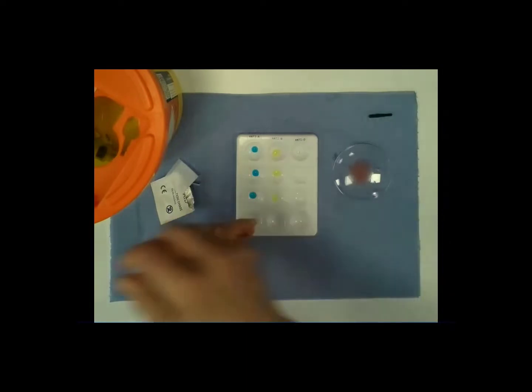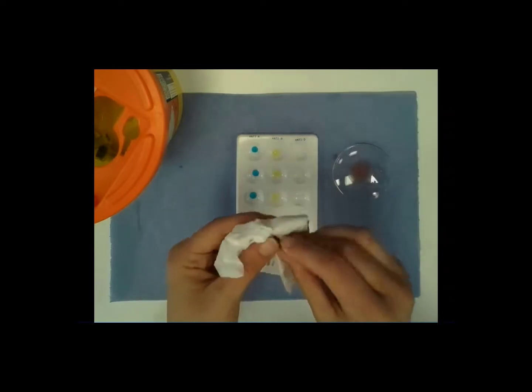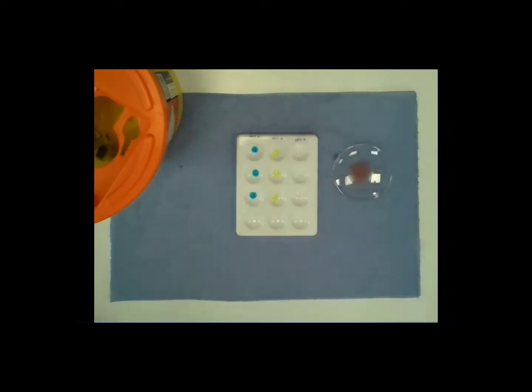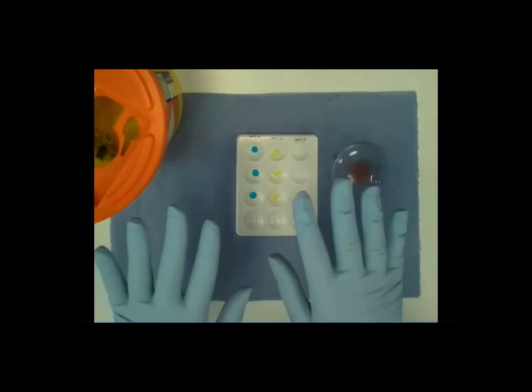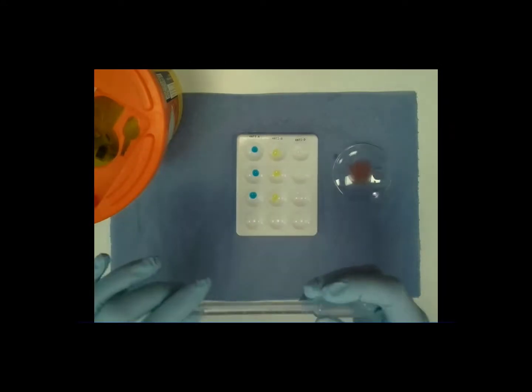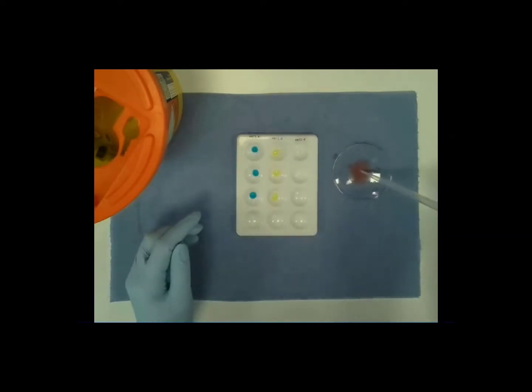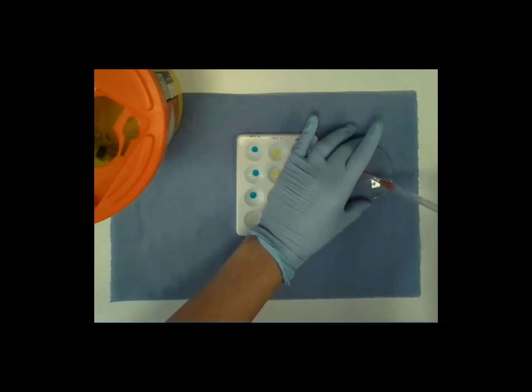Take a tissue and stop the bleeding on your thumb. Tissue and the waste swabs go into the clinical waste bin. And at this point, you should put gloves on as you're working with blood, and this is potentially hazardous. Take a plastic Pasteur pipette and carefully add 1 drop of your diluted blood to each of the wells that contains antibodies.